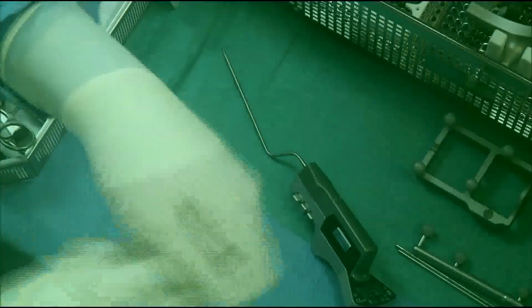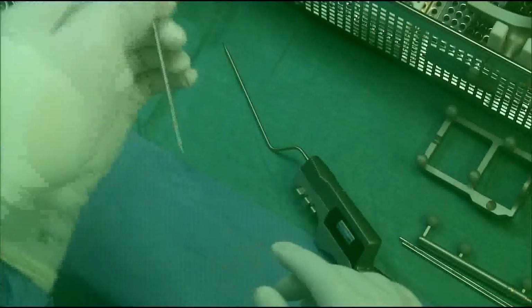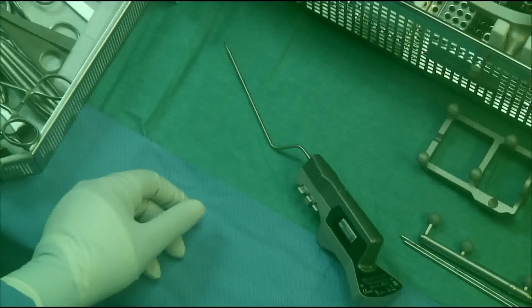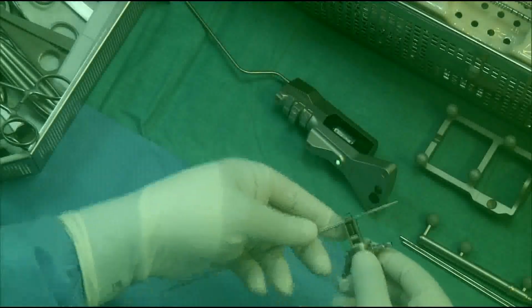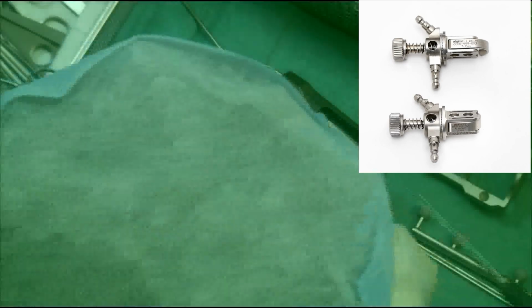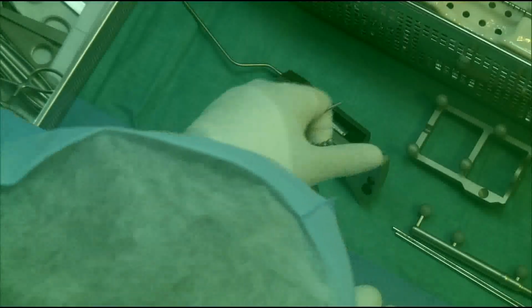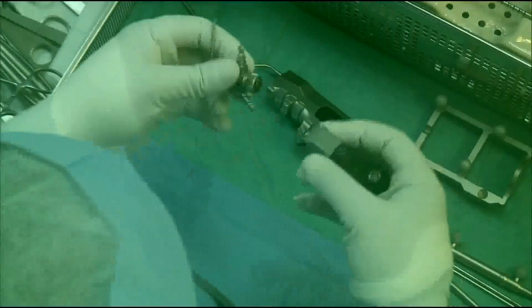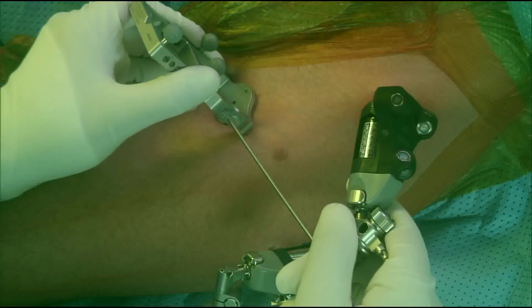The next and probably the most important part of this procedure is to create a device that would take us to the osteoid osteoma. This is the innovative part, because this device was designed for spinal surgery, not hip surgery. And it's really simple. Just connect the 2.5 threaded tip wire to one of these Stryker navigation devices and fasten it securely. Then attach the whole device to the tracker system. The next step is to identify this newly developed device to the navigation system.